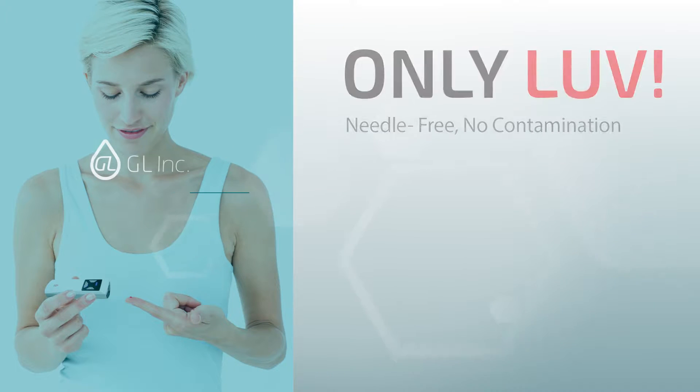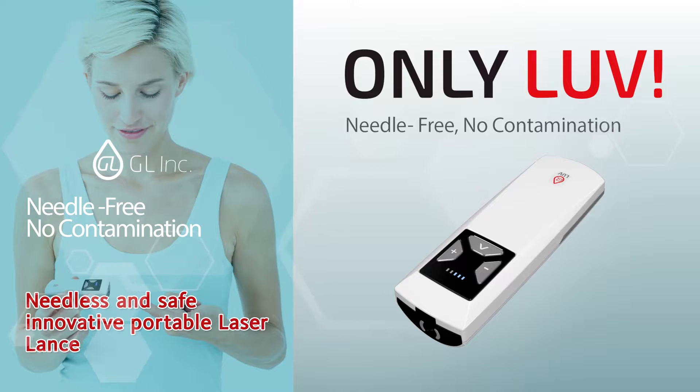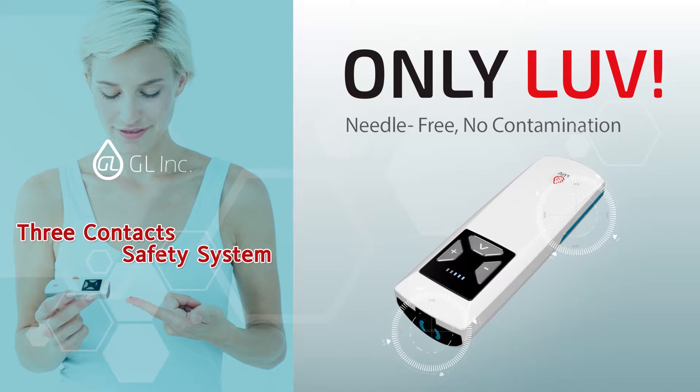A needleless, safe, innovative, portable laser lancet — LUV. LUV has adapted a three-point safety spot and is safer than other competitors' similar products.